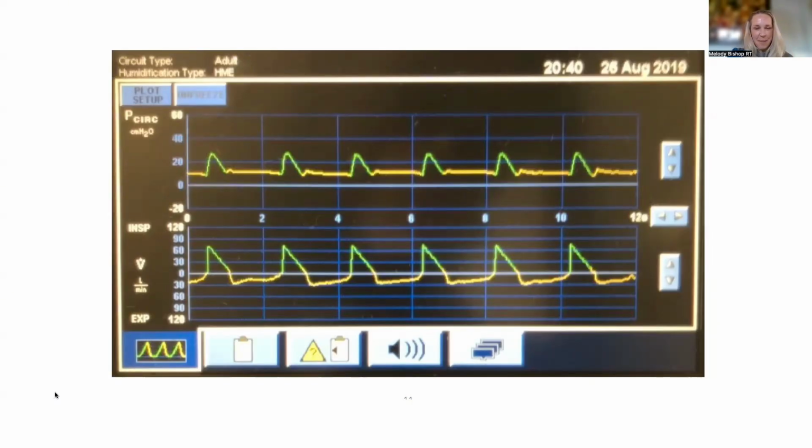So we're going to talk about waveform asynchrony or dyssynchrony. You talked about that last week, which was interesting. Can you just remind everyone, i.e., remind me, because people interchange them, but they're not interchangeable technically, right? There is a specific definition for asynchrony and dyssynchrony. Yeah, and I'll be honest, I didn't even know it when I first learned. I learned it as asynchrony, but through the course of my learning, I corrected myself with more knowledge.